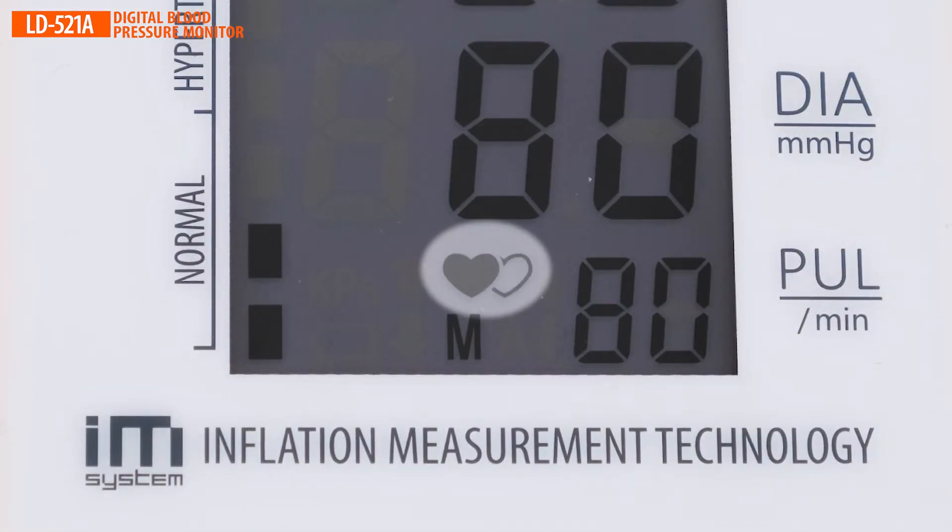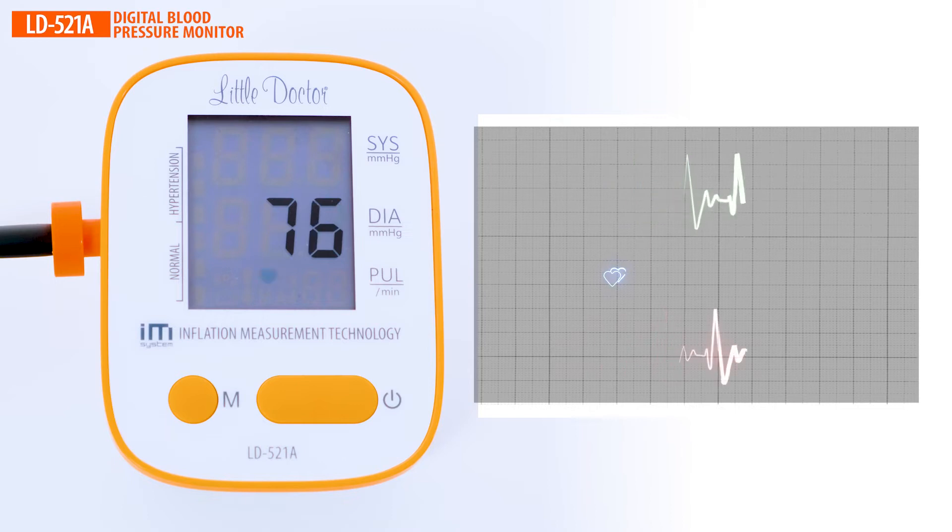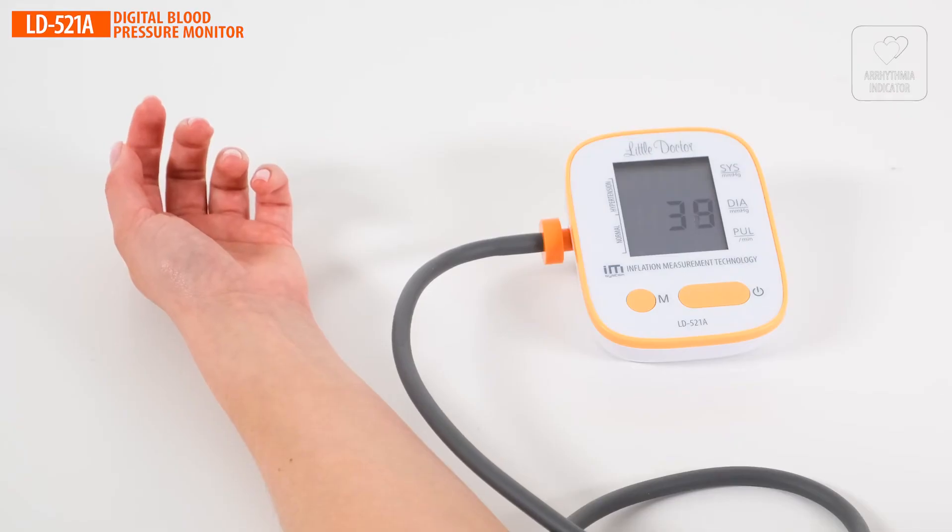The arrhythmia indicator icon appears on the device screen. During the measurement, the monitor analyzes the beat-to-beat intervals. If the icon repeatedly appears on the screen, it is recommended to seek medical assistance.